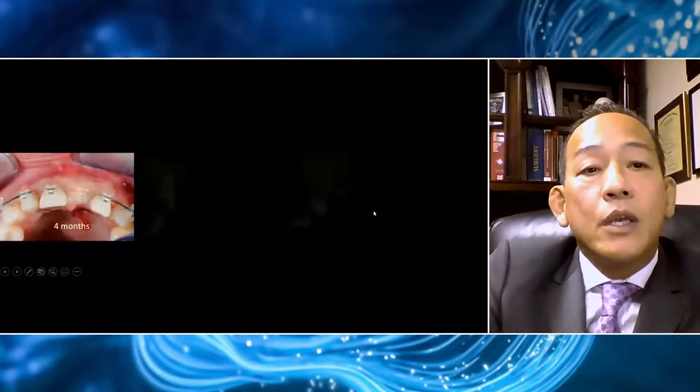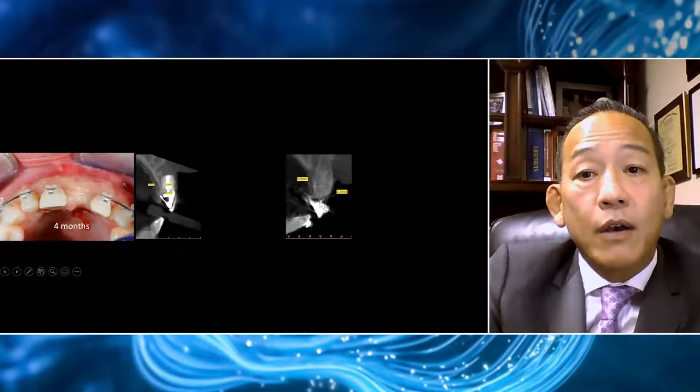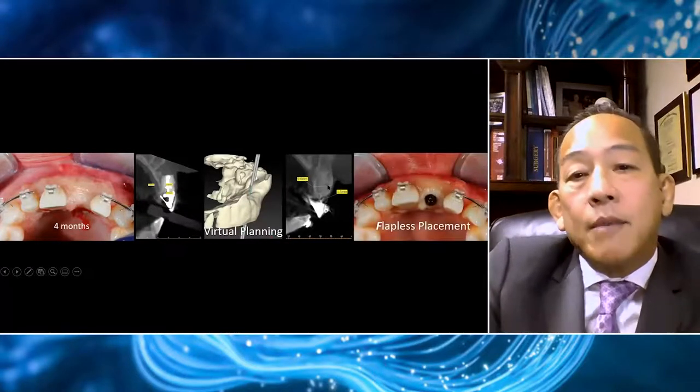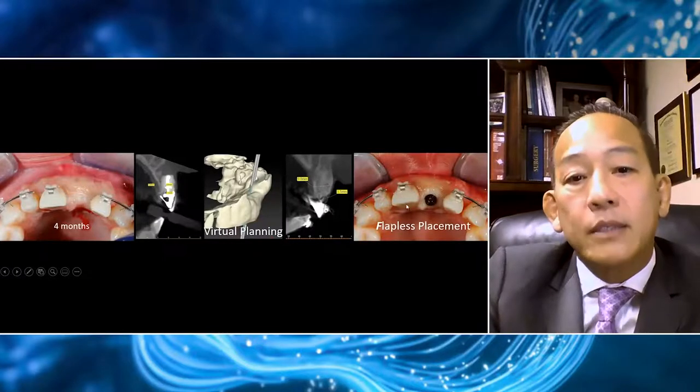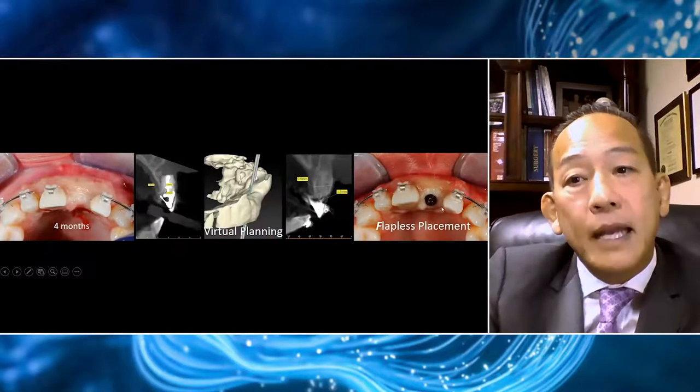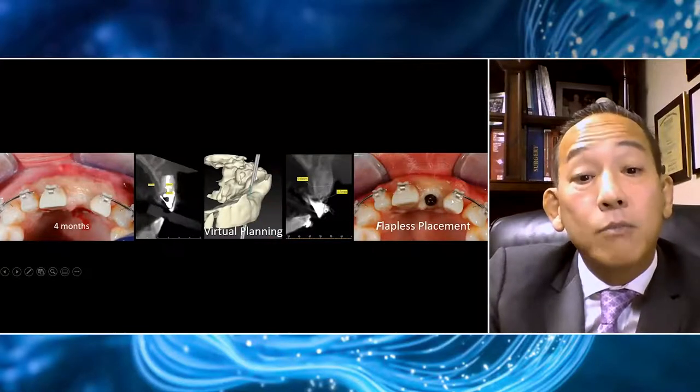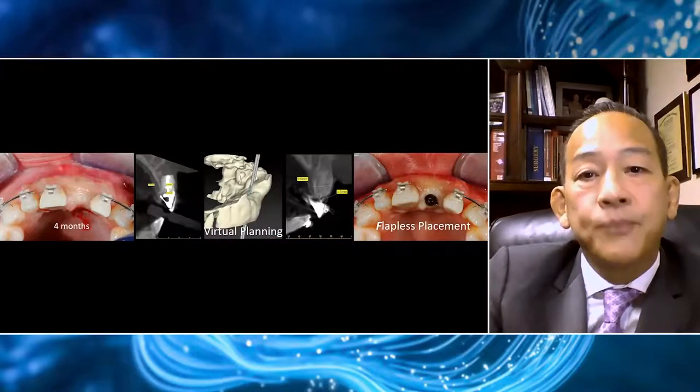You can see the before and after CT scan — the bone is at the high crest position, overcorrected relative to our prosthetic tooth. We have an abundance of bone vertically, so we can place the implant with very little flap elevation. In my practice, when we achieve a high crest with adequate keratinized tissue, the implant is always placed flapless. There's not a drop of blood after we wipe it clear, the patient has much less pain, and there's no disturbance of the new soft tissue we have developed. The extra vertical tissue height is easily managed — we just displace it with our provisional.